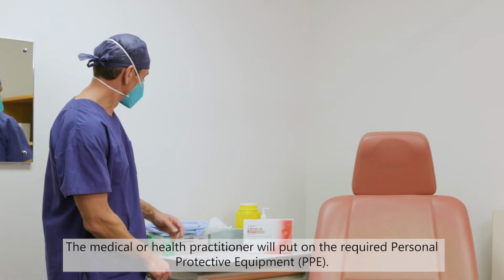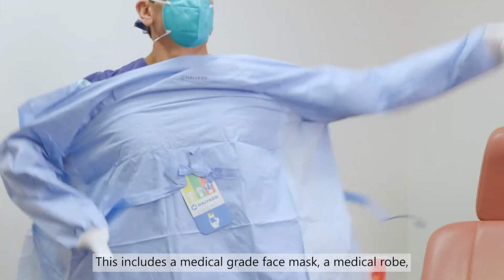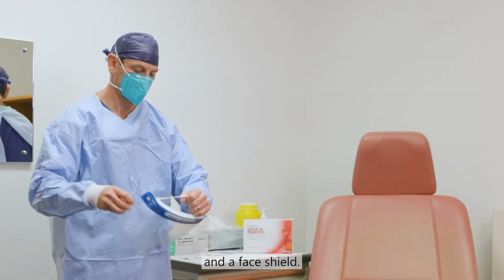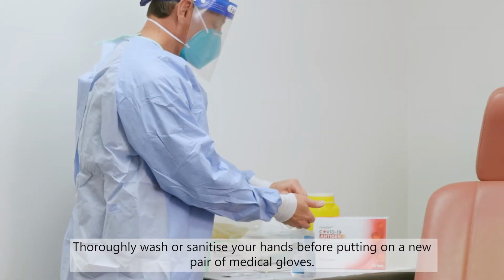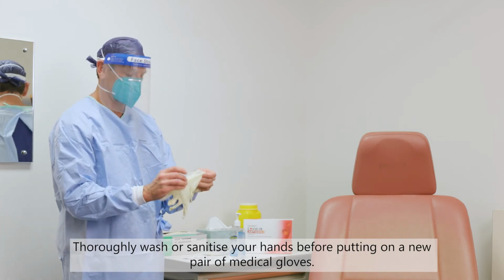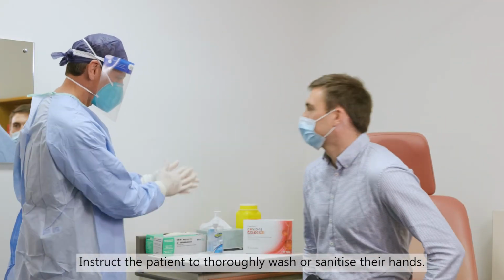The medical or health practitioner will put on the required personal protective equipment, PPE. This includes a medical-grade face mask, a medical robe, and a face shield. Thoroughly wash or sanitize your hands before putting on a new pair of medical gloves. Instruct the patient to thoroughly wash or sanitize their hands.